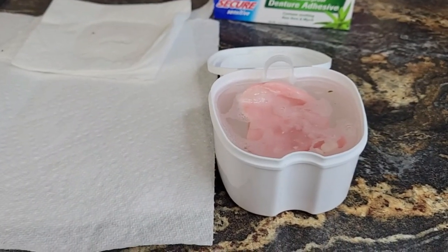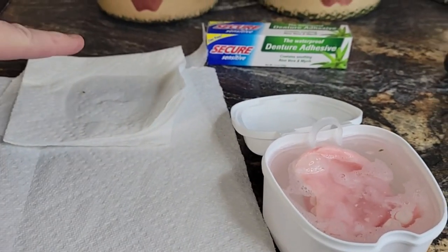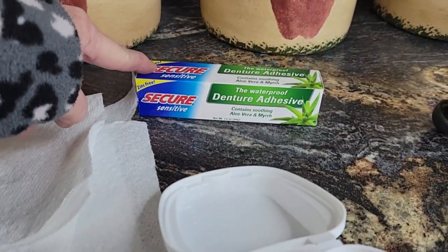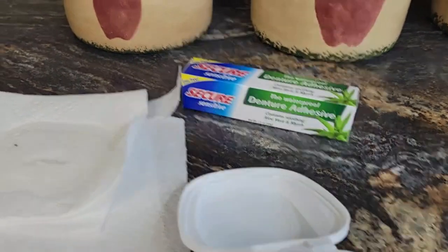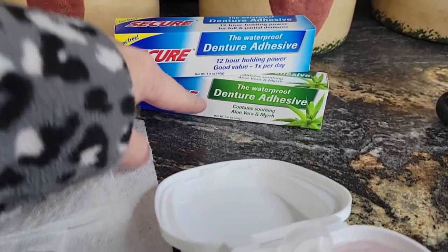Last night, I put my teeth in this cup with an effervescent tablet. I didn't rinse them off because I wanted you to see why they claim this is waterproof. I'm using this Secure. This is the one I had on there. They also sell this one. I have it here. They also sell both of these, but I used this one.